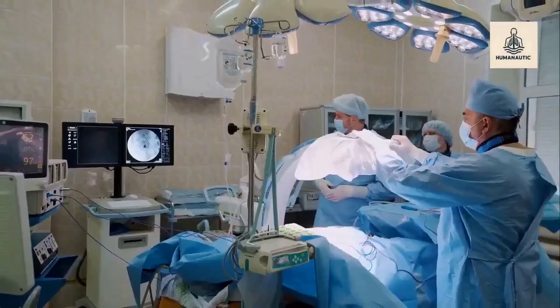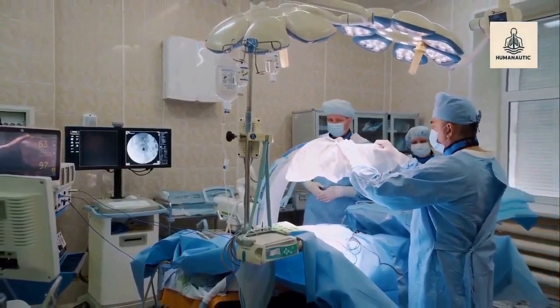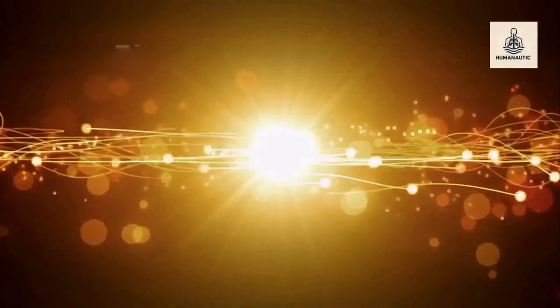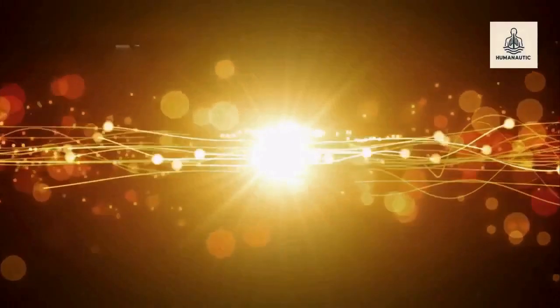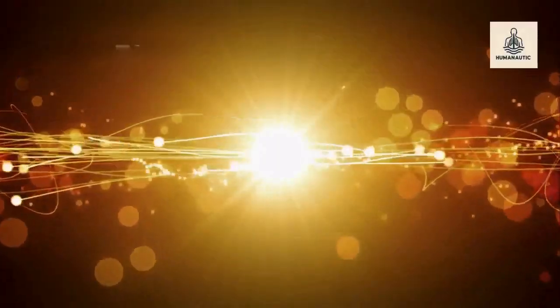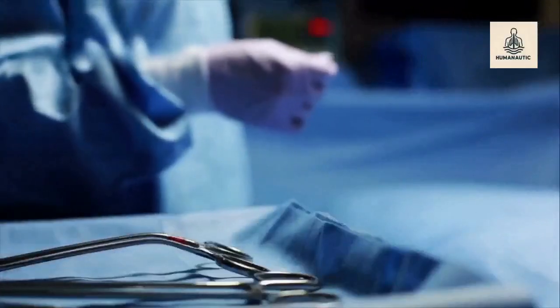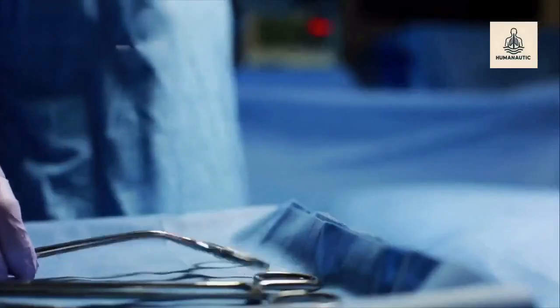Hand motion scaling. Small hand movements result in fine internal movements. Reduced haptic feedback. Force judgment is primarily visual. Energy application principles. Understanding thermal spread and avoiding collateral effects. These tools emphasize precision, leverage, and delicate tissue handling, not force.